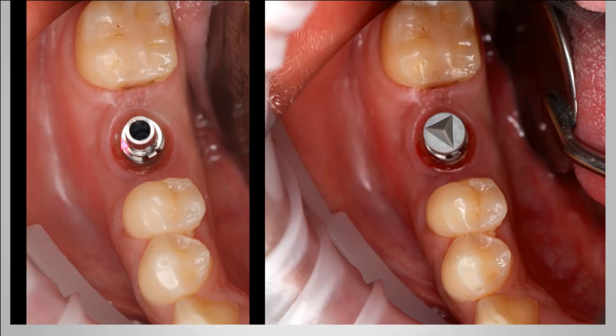Here's what the scan post looks like when it's seated intraorally. Now, if you pay attention, you will see that the notch is facing the proximal surface. It's important to face this notch on a proximal surface because during the design of this CAD/CAM restoration, the sprue will be 90 degrees from this notch. Hence, the sprue will either be towards the lingual or the facial.